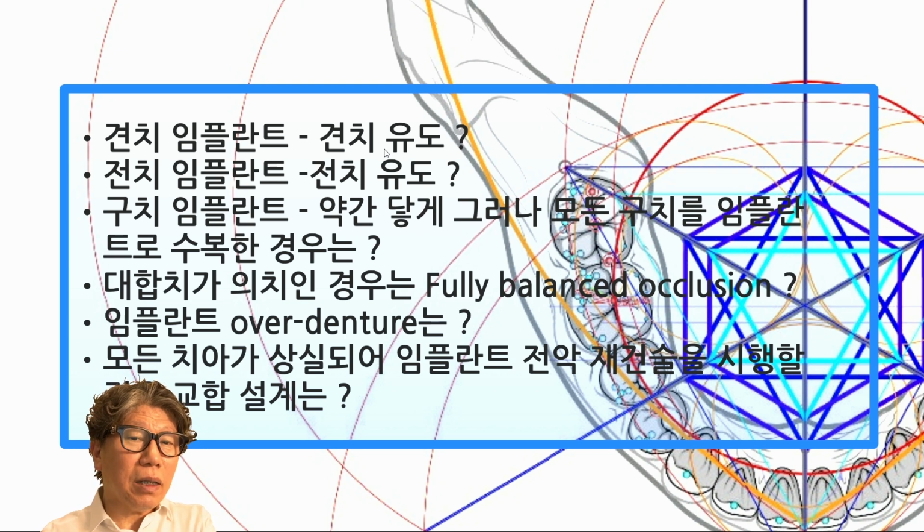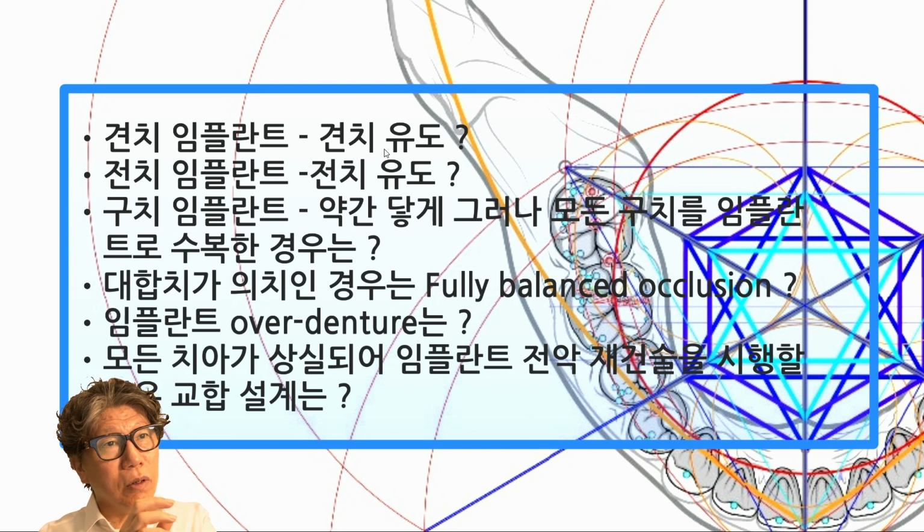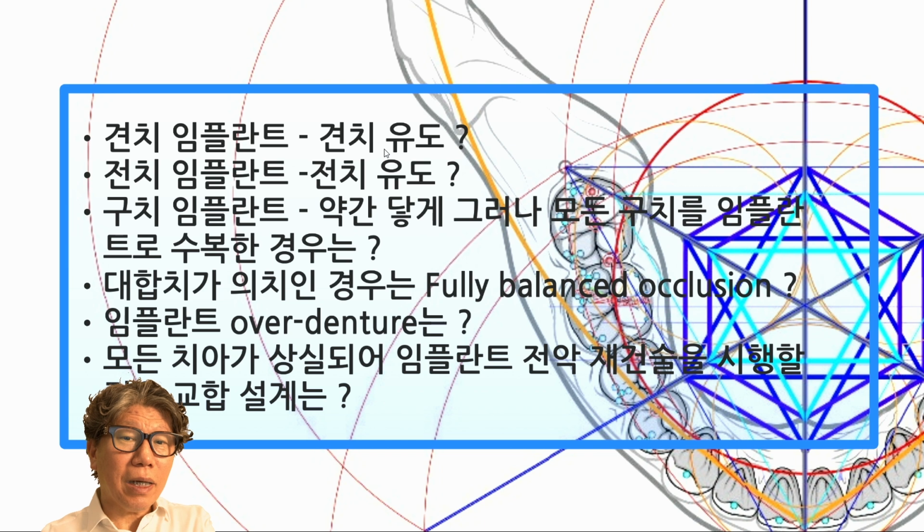In my case, when applying canine guidance, if the tooth responsible for canine guidance is lost, I sometimes place a fixture with a length of 13 mm for a canine guidance implant, and at other times, I have placed a fixture with a diameter of 6.2 mm. Anyway, if there is bone, I try to implant the thickest and longest possible. And next, I choose an implant type with a strong connection, such as locking taper or Torex. When the prosthetic restoration is done, canine guidance is applied. Otherwise, if a regular implant is used, it would probably be done with group function.